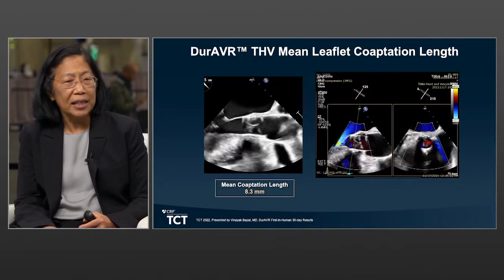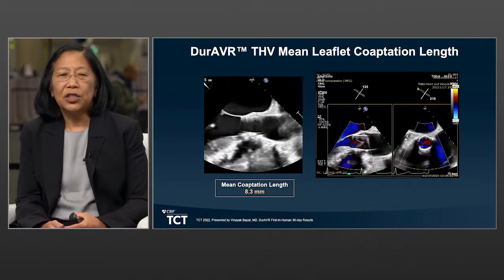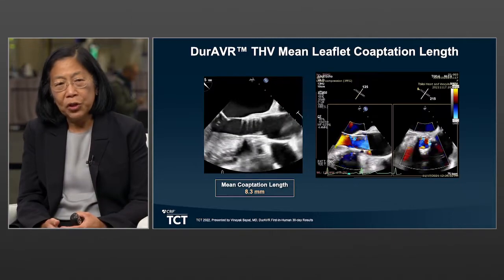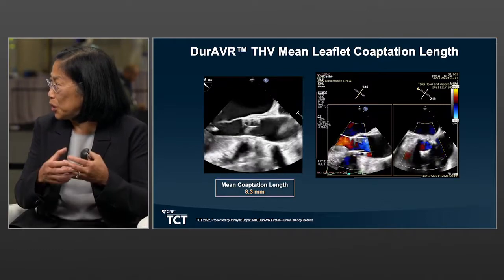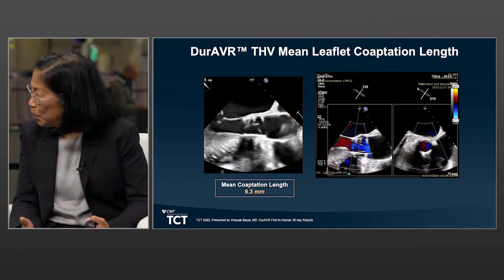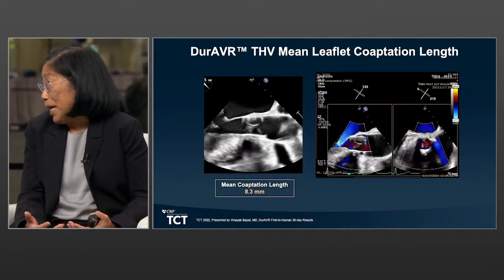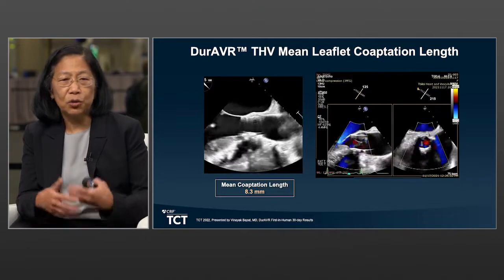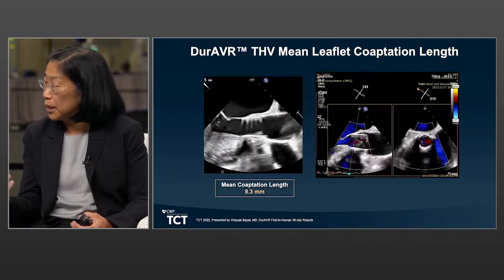But I do think that if it does, and I think you've shown me data that it actually does have excellent hemodynamics, it's going to play a role eventually also in durability. So when we look at, we know that the surgical valve has a sewing ring, and so it's naturally going to be a little smaller, and we've shown that the prosthesis patient mismatch is going to be better for the TAVR valves, but hemodynamics matters. And so if you have low gradients, big valve areas, the leaflet stress is less, and my suspicion is that it will play a role in also durability.